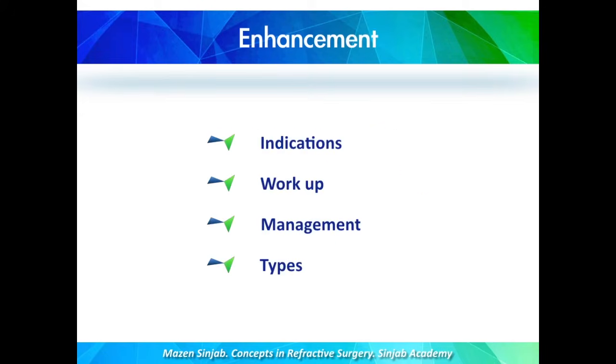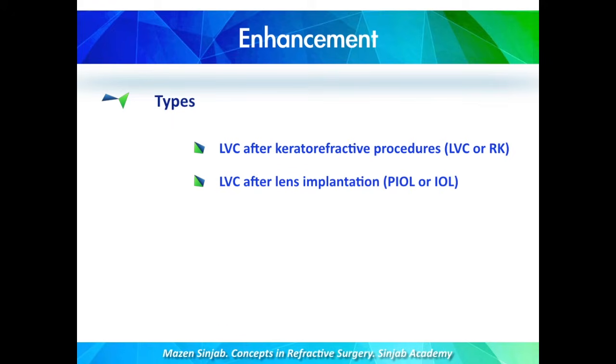By this, we come to the types for enhancement. There are 2 types of enhancement according to the laser profile. There is the optimized laser profile and the customized laser profile. In addition, there are 2 types according to what we are going to do. Either we do laser vision correction after keratorefractive procedures, such as laser after laser vision correction or RK, or we do laser vision correction after lens implantation, either phakic IOL or IOL.